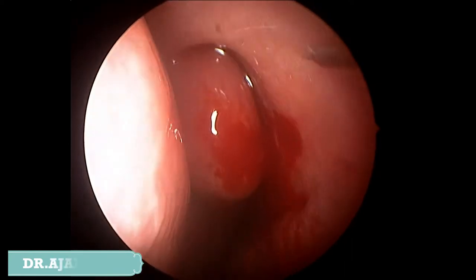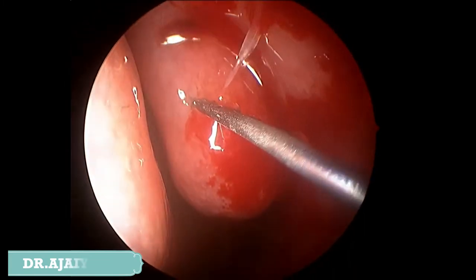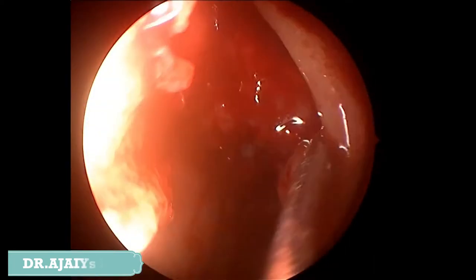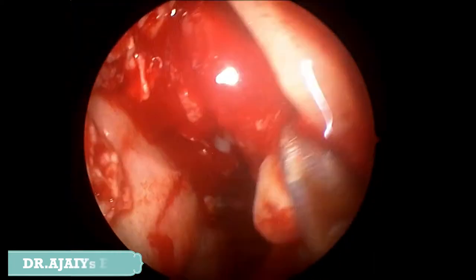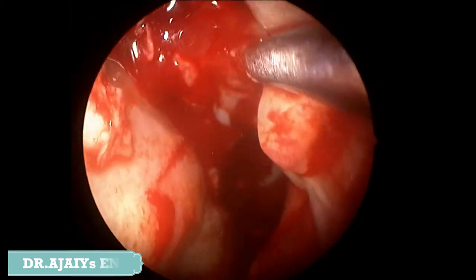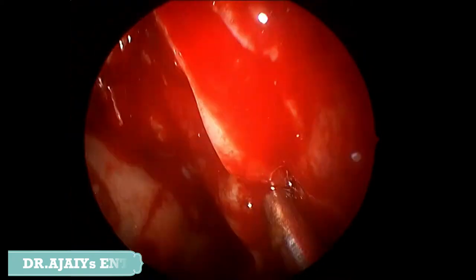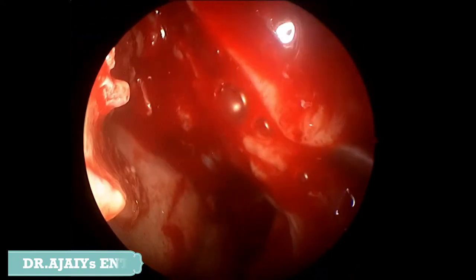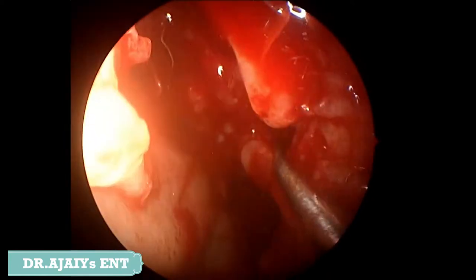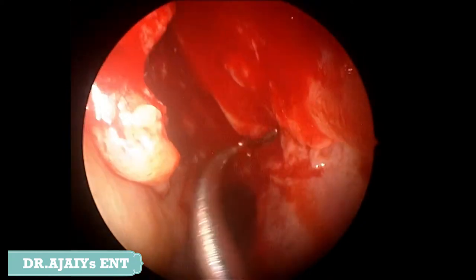We did a concaplasty and performed infiltration along the middle turbinate and along the uncinate process. The first step was uncinectomy. Using a ball probe and just opening up the maxillary sinus ostium, we could see some purulent secretions coming out from the maxillary sinus ostium, and then we proceeded with a wide middle meatal antrostomy.